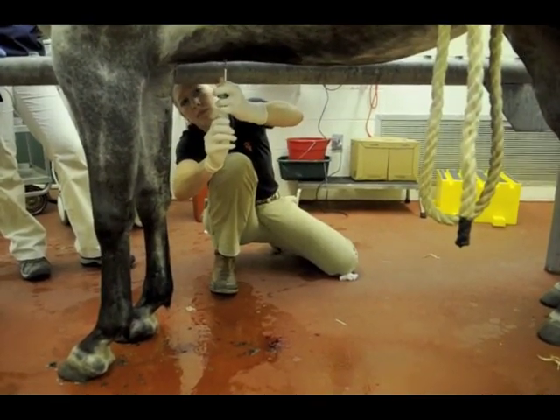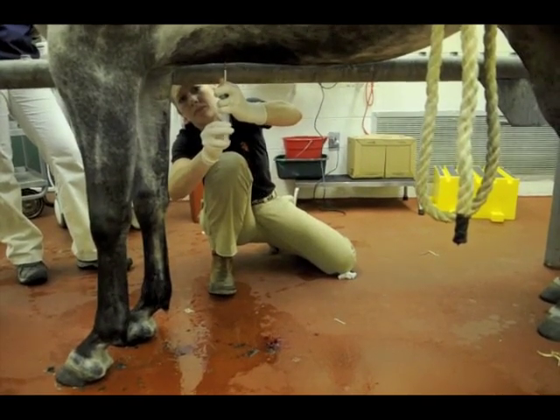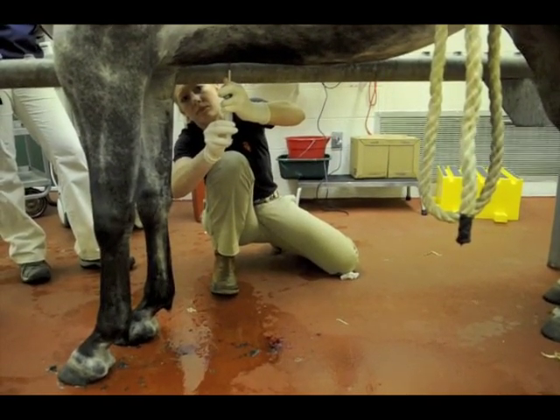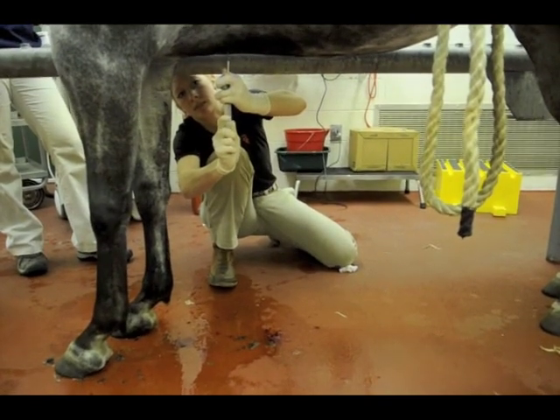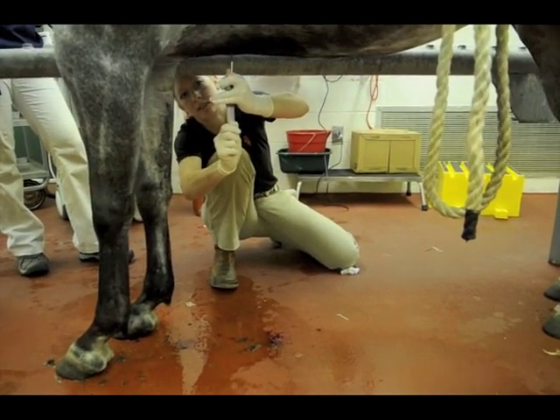We get about five to seven cc's of bone marrow. After that, we take the bone marrow to the laboratory where it's processed and the stem cells are isolated in culture.